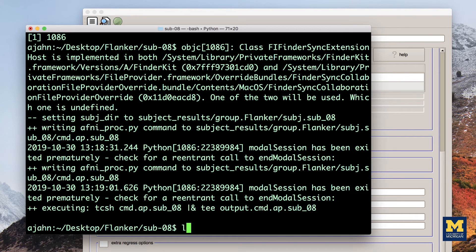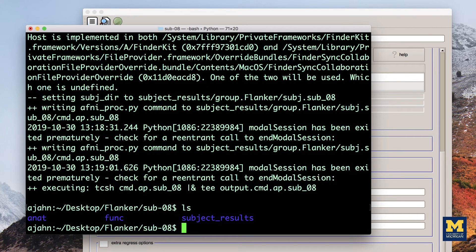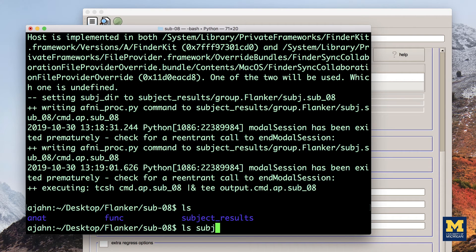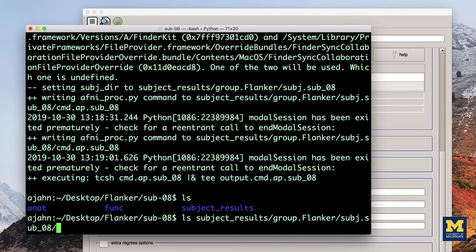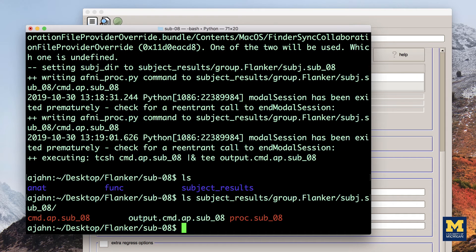From the sub 08 directory, notice that there is a new directory structure that has been created. Within the directory subject underscore results, you will see another folder, group flanker, and below that, a folder called subj dot sub 08. Within this directory, there are three files you should be aware of.